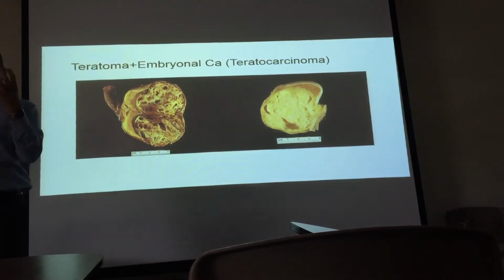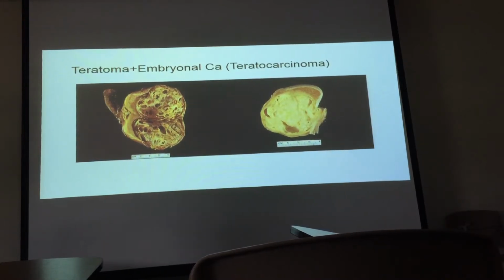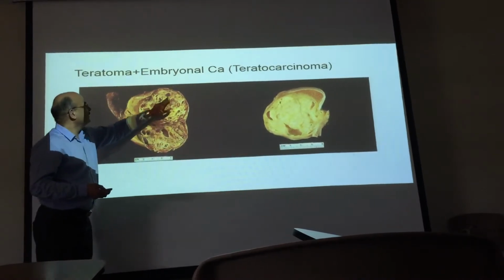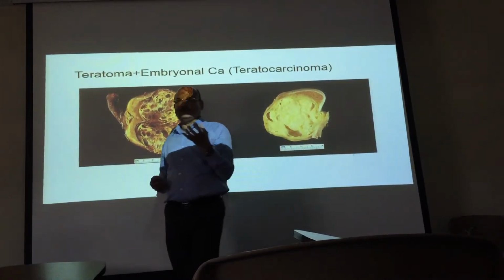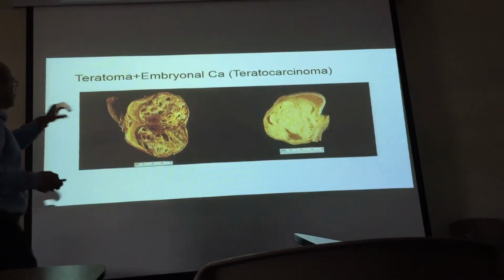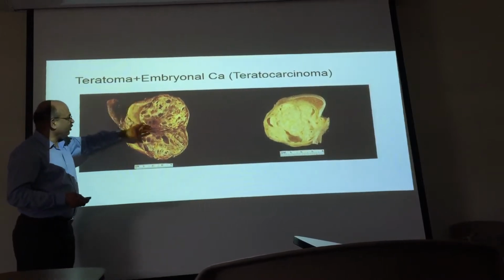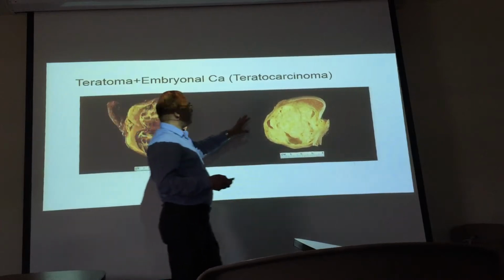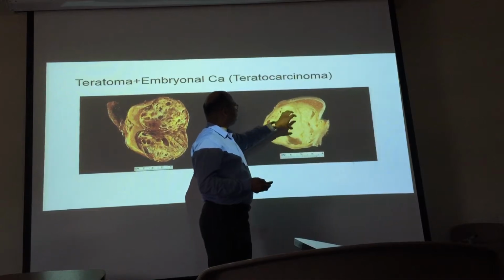Most obvious feature. Very important feature, the difference between these two and the previous one. Necrosis. Yes, you can see necrosis and the cavities. It's not a solid looking tumor. It is cystic with some solid areas. It is more cystic with multiple cavities, and it is necrotic also, and the capsule is also invaded. And it is relatively less necrotic, and you find these cavities of cystic degeneration in some solid areas.